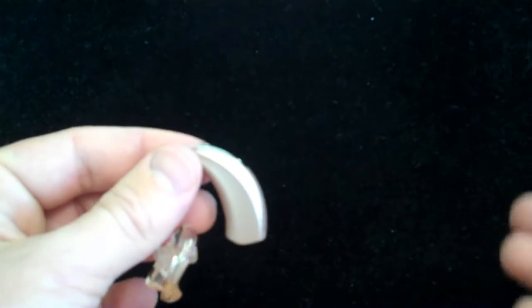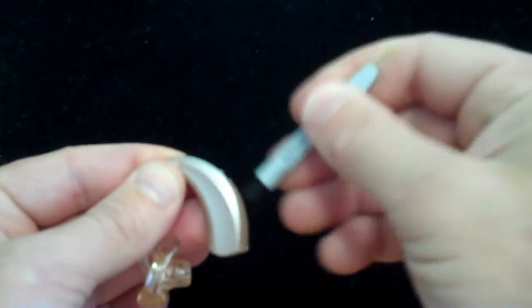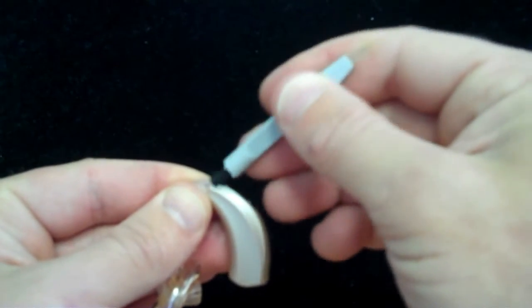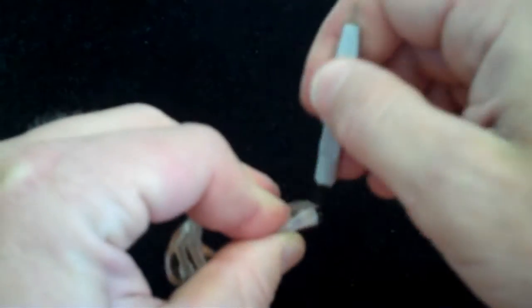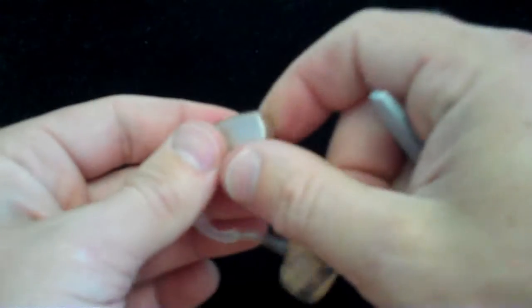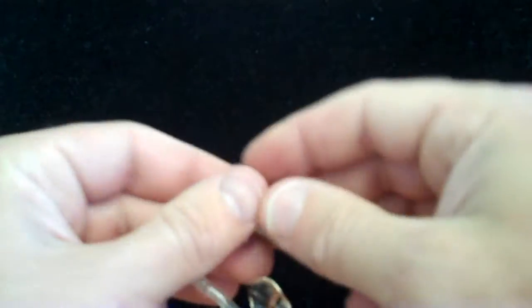The last thing you may want to consider with the hearing aid itself is using the brush side to clear any debris over the sound inputs or microphone ports on top of the hearing aid, the microphone opening in the front as well. On occasion, you may even wish to open the battery door and brush that out as well.